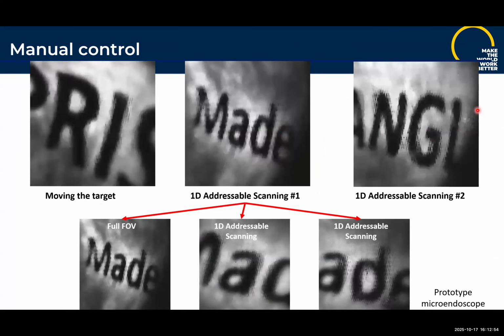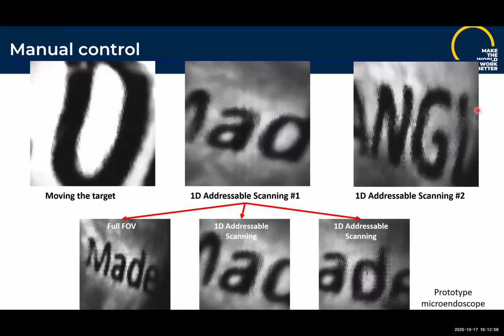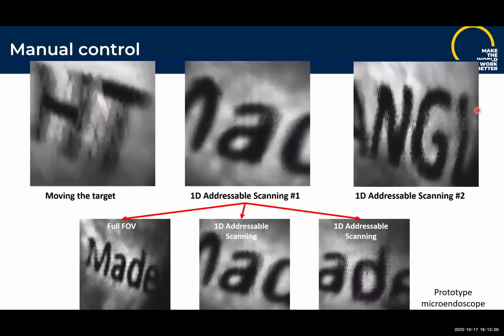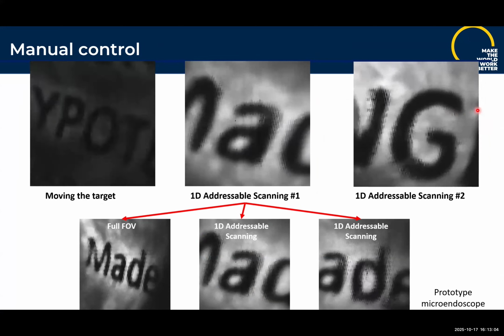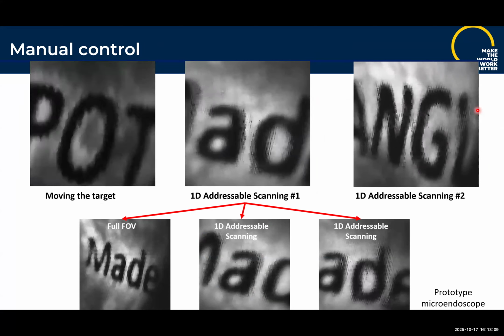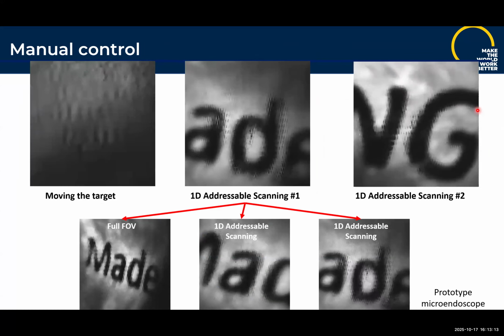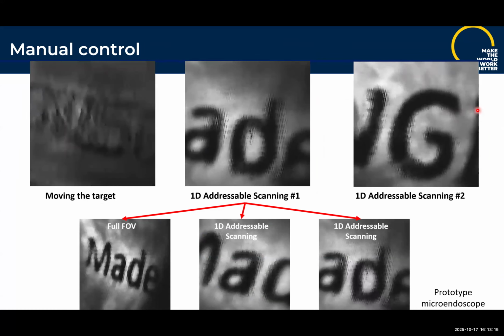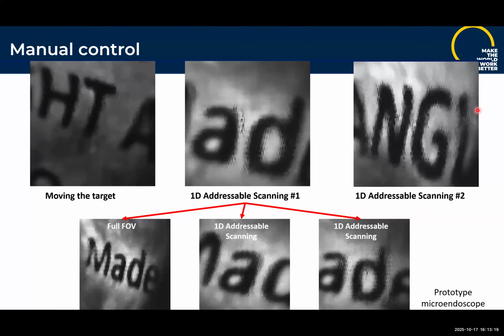This is just some basic wide field imaging of these random access scans. So June is holding his system near a piece of text in the lab, and he's zooming in on it by adjusting the scan pattern down to narrow regions. But he's doing this manually here. He's just very slowly adjusting DC voltages and frequencies and so forth to make this work. And that's not very efficient.